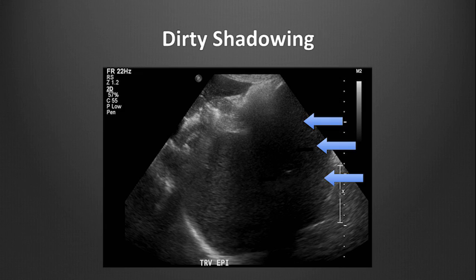Dirty shadowing can make point-of-care ultrasound of the abdominal organs difficult in some cases. These shadows are caused by the air within the bowel, which scatters the ultrasound beams and makes it difficult to see what is deep to the air-filled tissues. These dirty shadows are often more gray, with less crisp edges. Gentle compression of the probe on the abdominal wall surface compresses the bowel, minimizing air. And this can often slowly improve visualization by decreasing dirty shadowing from bowel gas.